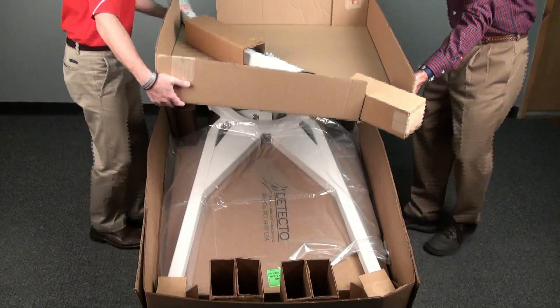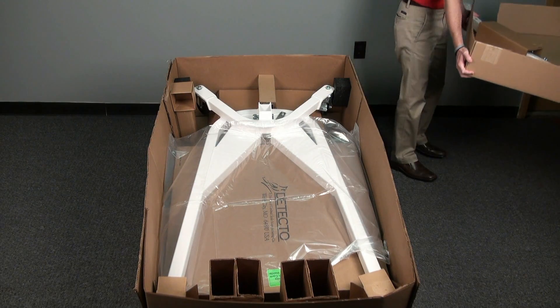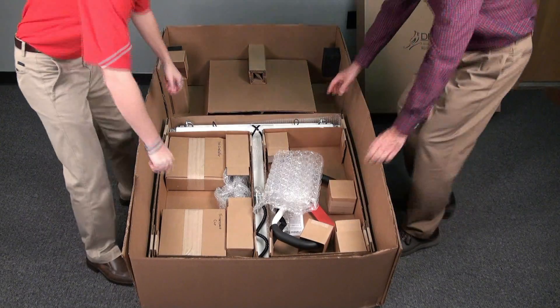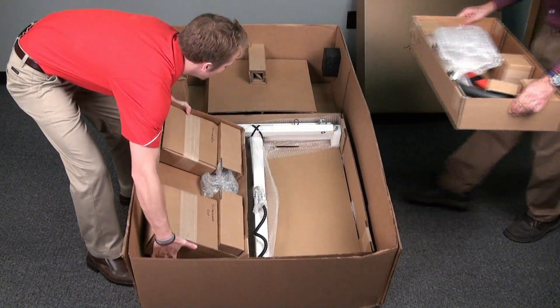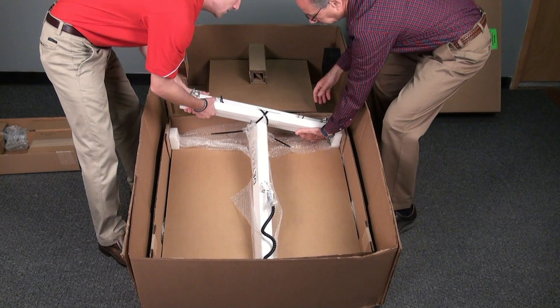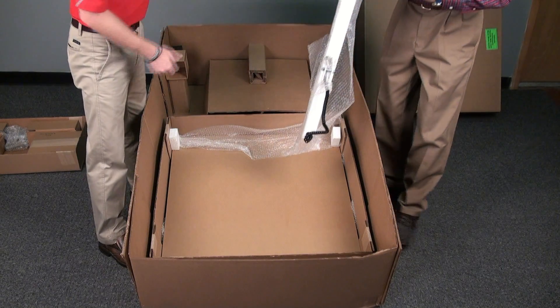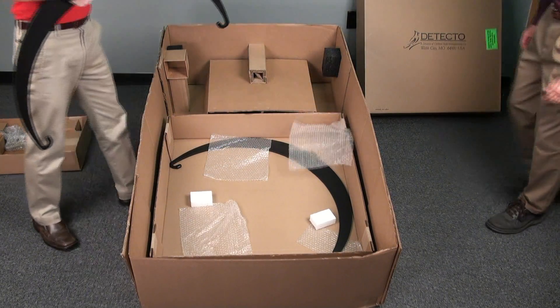Begin by removing the column assembly from the box with the help of an assistant and setting it aside. Next, remove the base assembly and then open the inner box that has the remaining parts and indicator, setting each of them just outside of your workspace until they are needed. Take care to keep the boom assembly packed and strapped until it comes time to attach it. Finally, remove the support hoops at the bottom of the box and set them aside.